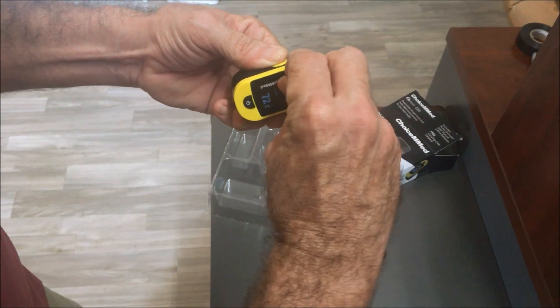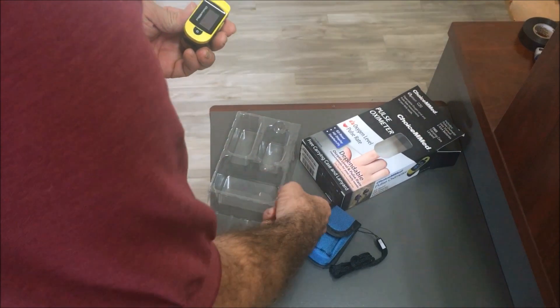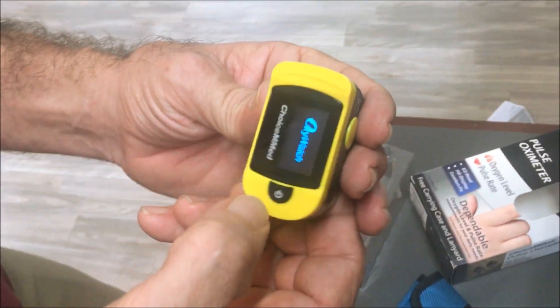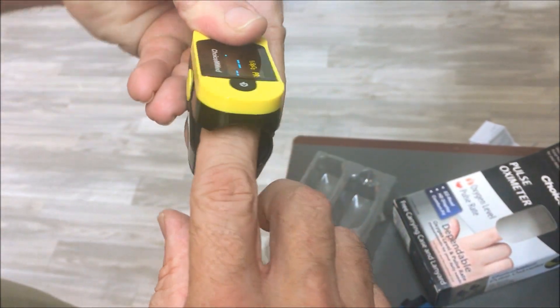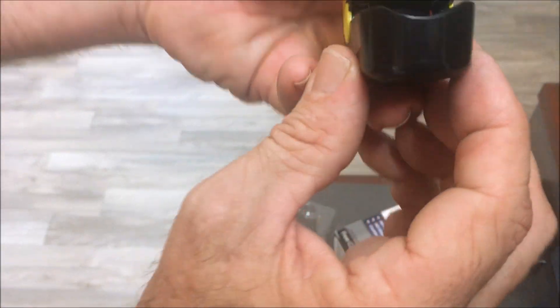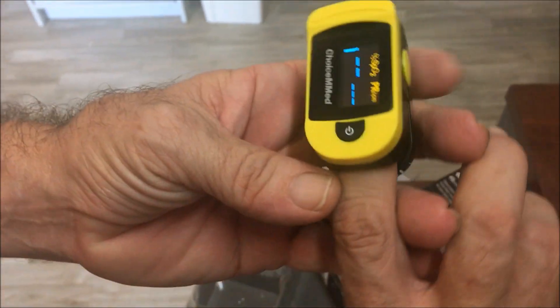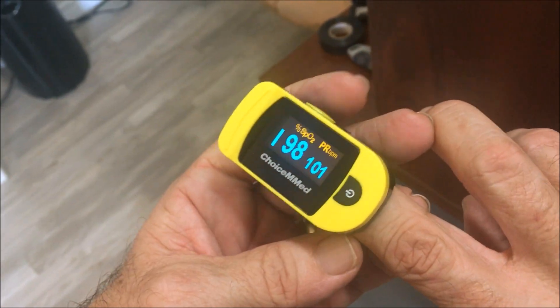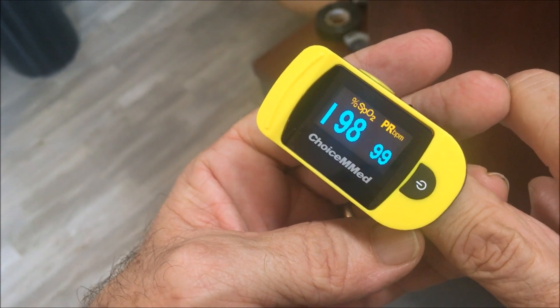The pulse oximeter itself comes with a protective covering that you just peel back — that comes right off, no problem. To turn it on, you press the button and it pinches apart like a clothespin. You stick your finger inside, and you can actually see the light blinking in there — those are the light emitters we were talking about.